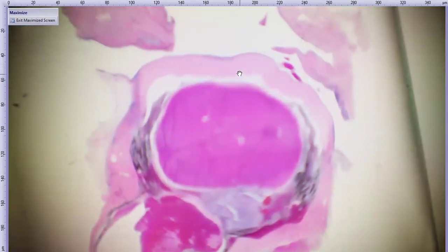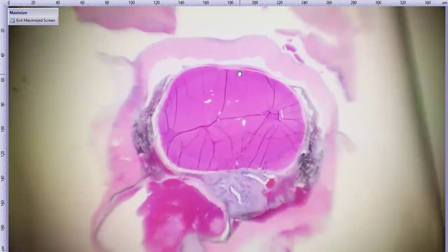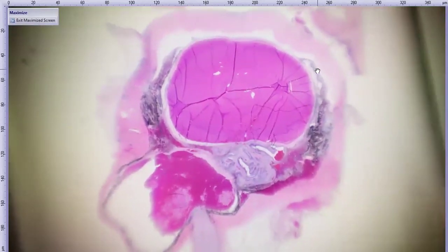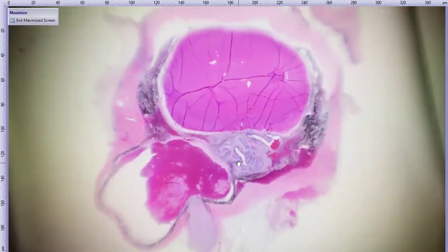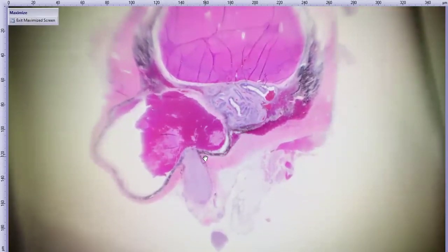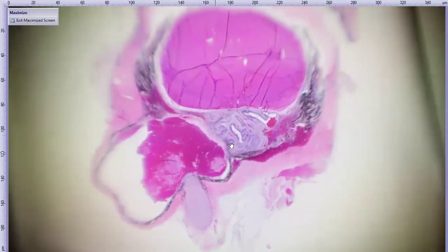Upside down. Here we go. All right, so again, extra adnexal structures up here. Got some very nice whisker hairs. Here is our cornea. Our big lens in the center. You can still see our uveal tract. Looks like that white tissue that we were seeing grossly here is a balled up piece of retina. Lots of hemorrhage here in the subretinal space. Here's our optic nerve, and again, wrinkling and a shrunken, misshapen globe consistent with phthisis bulbi.